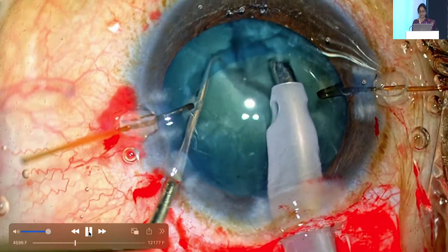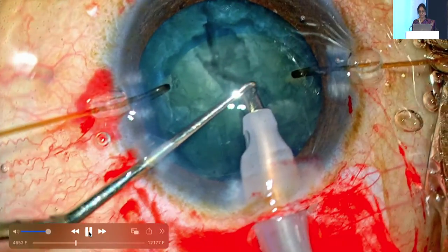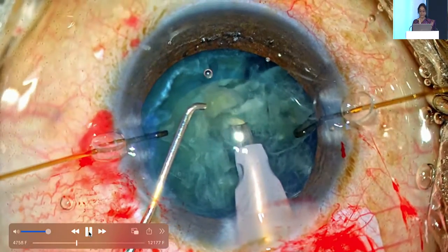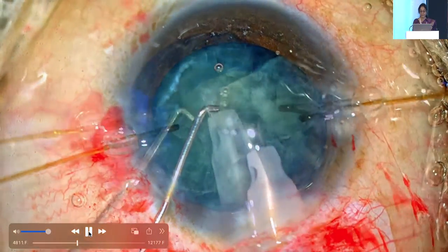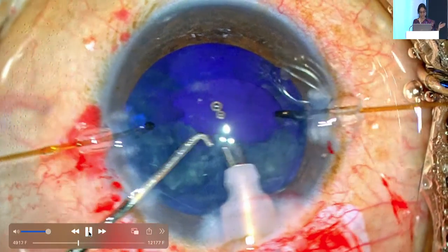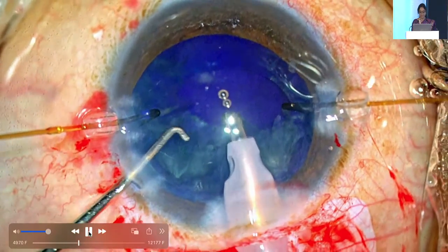So I proceed with the lateral separation here. And all these maneuvers take a lot of time. Though we edit videos and show it in a very short period, it does take a lot of patience. It tests your nerves. As Dr. Nidhi said, keep your nerves calm.